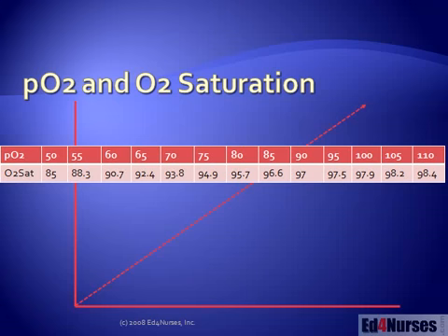Here you've got the two numbers. The top one is the PO2, the bottom one is the O2 sat. So if you think about O2 sats, normally we like to keep our COPD patients somewhere in a range of about 93, 94 for their O2 sat. Now, you see that correlates with a PO2 of somewhere around 70. If we have that patient's oxygen saturation way up here at 98, like it was in this case, we've driven the patient's PO2 up to 100 or more.